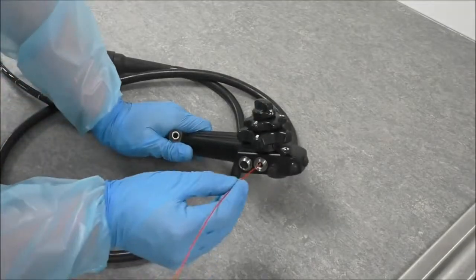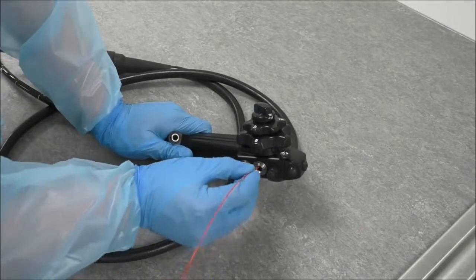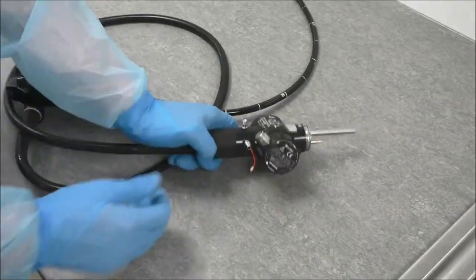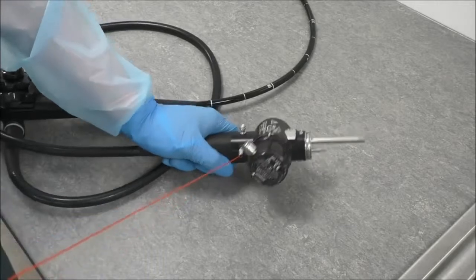Here is a generic channel cleaning brush for single use only that will be used in the next demonstration. Insert the suction channel cleaning brush straight down the suction cylinder until it appears from the suction connector in the LGC, then pull through the U-cord.